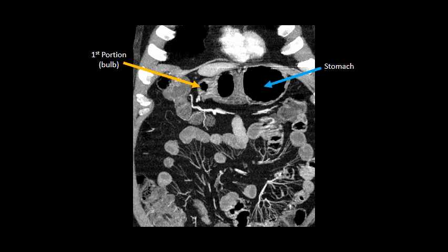Here we can see the stomach, indicated by the blue arrow, and the first portion of the duodenum, or the duodenal bulb, indicated by the orange arrow.